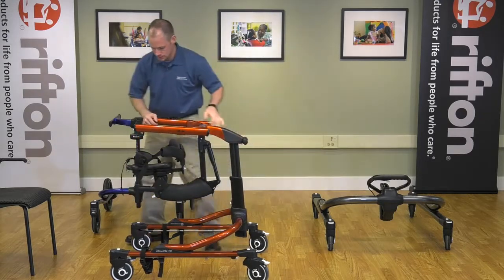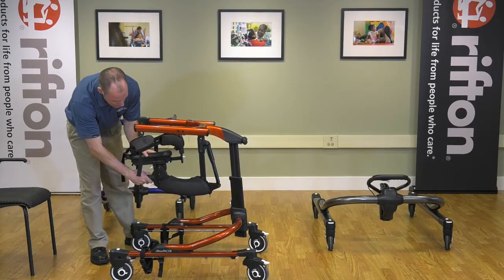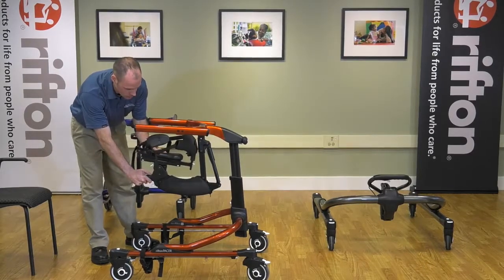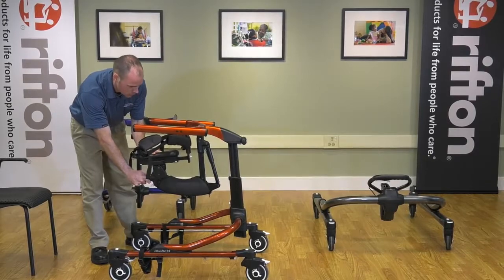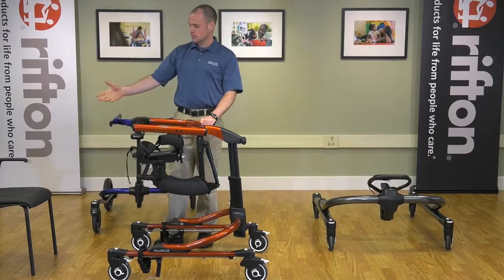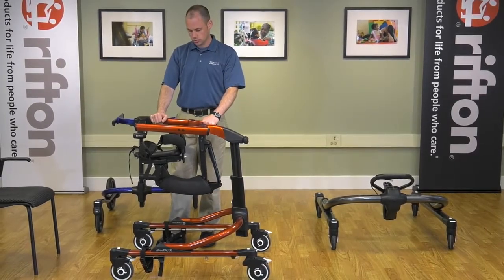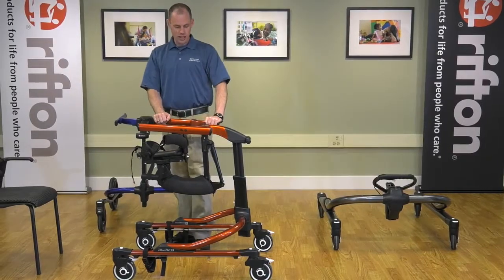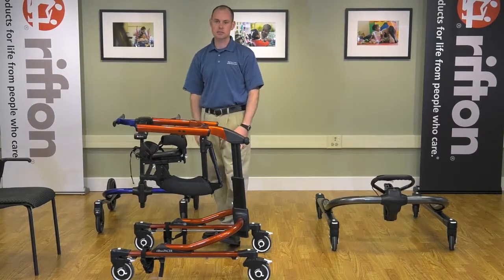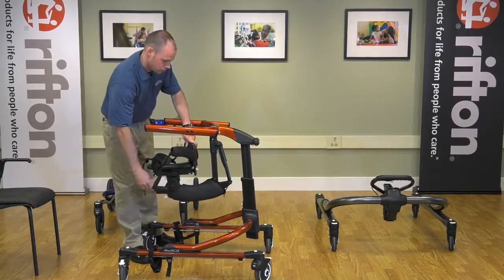with your main height adjust, and then you can always adjust the multi-position saddle using the height adjustment, the seat positioning forward and back, the tilt, as well as the adjust for the hip corral. So that is the basic procedure of loading a client into the dynamic pacer. Again, one of your great features is that you have a single column at the front, giving you great accessibility from both sides.